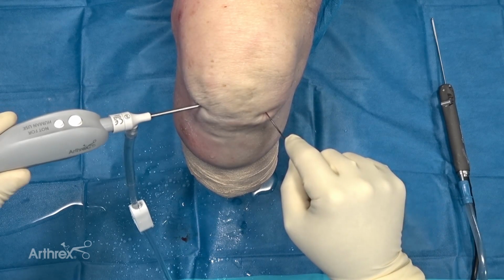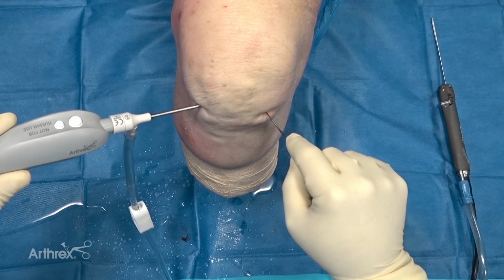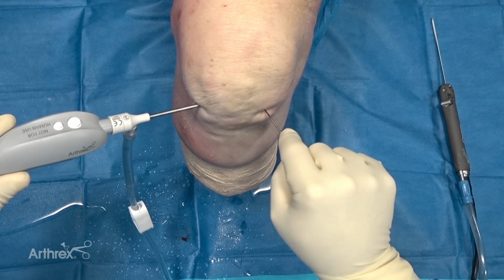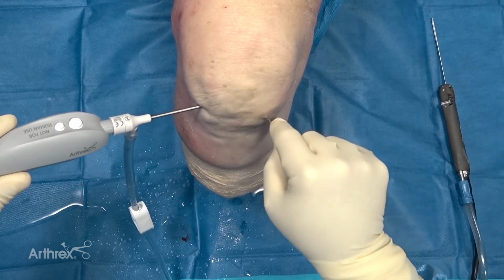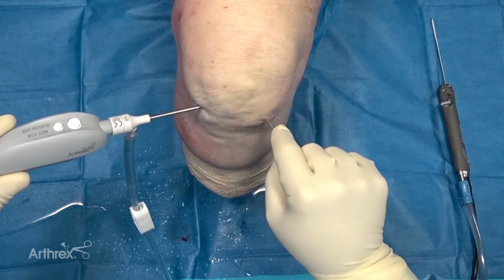Okay, so we're going to demonstrate the Nanosaber, and first we obviously have to percutaneously make a portal here on the medial aspect of the knee to get the Nanosaber in. So we're going to come in with a spinal needle, and here you can see we're in with a spinal needle. We're going to take the center cannulation out of the spinal needle. We're going to place a nitinol wire into the knee joint, and this helps dilate this up so that we can actually place it percutaneously.